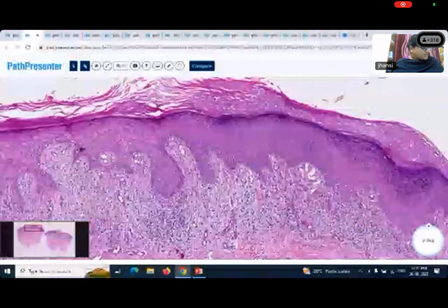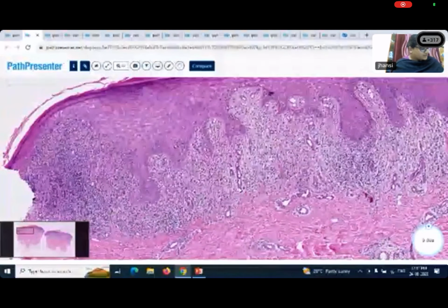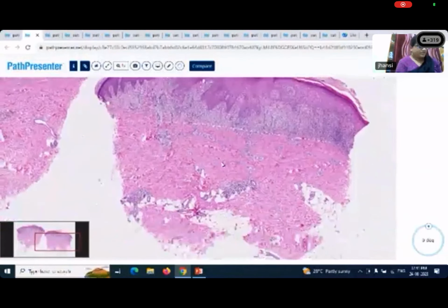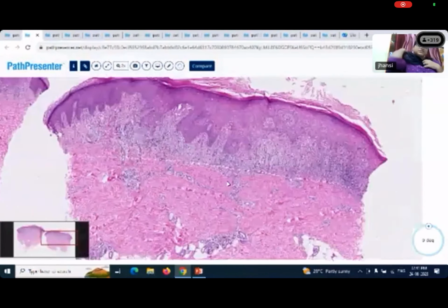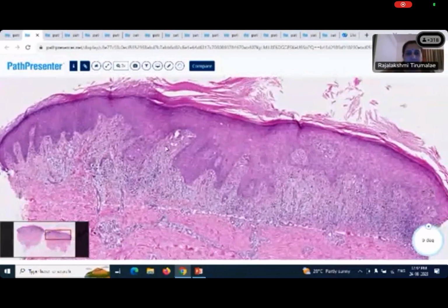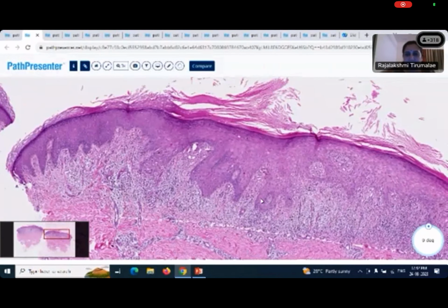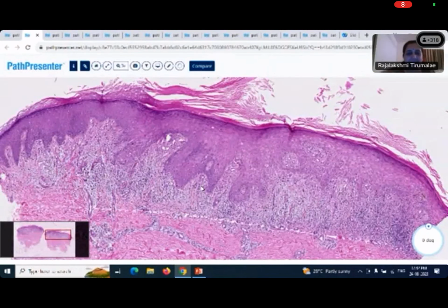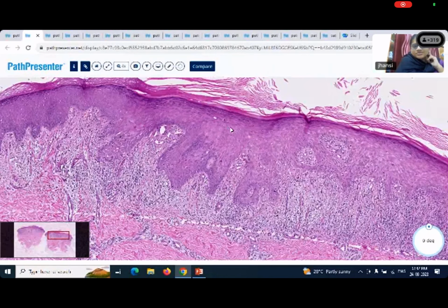And superficial dermis shows a dense band-like infiltrate, predominantly comprising lymphocytes, ma'am. Reticular dermis shows the fibrocollagenous tissue and the skin adnexa, ma'am. So there are no changes in the deep dermis or in the subcutis, right? Any negative points that you would like to add? Anything that you're not seeing, considering that the history is that of an itchy violaceous plaque? Anything that's important? I think the diagnosis is pretty straightforward, so I'm not worried about that.